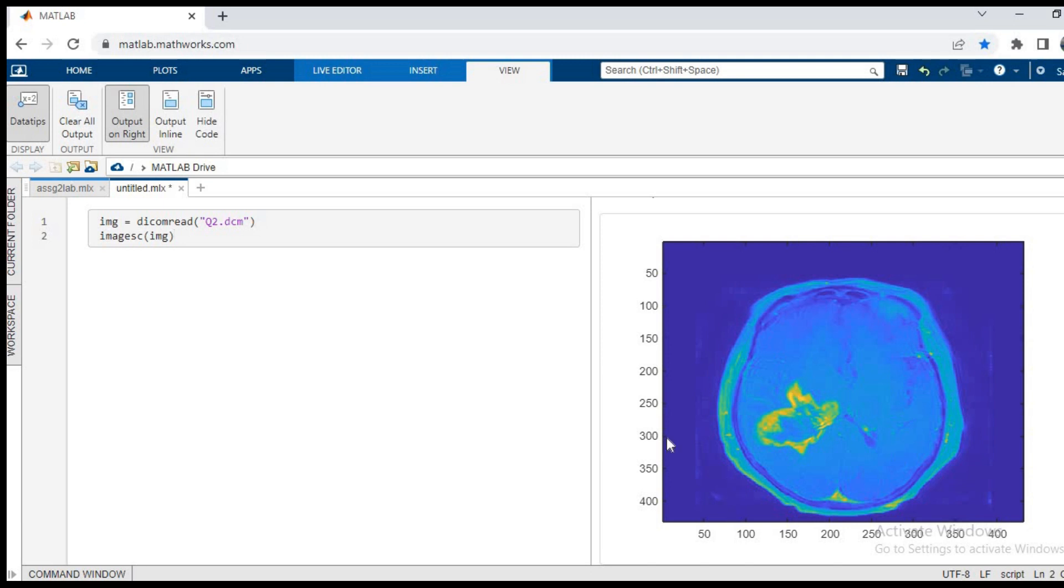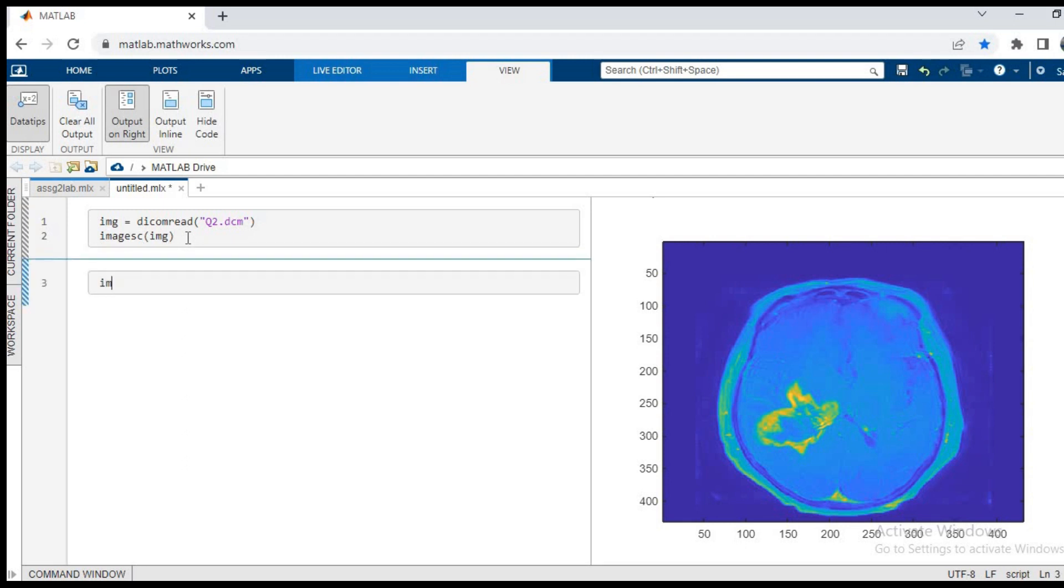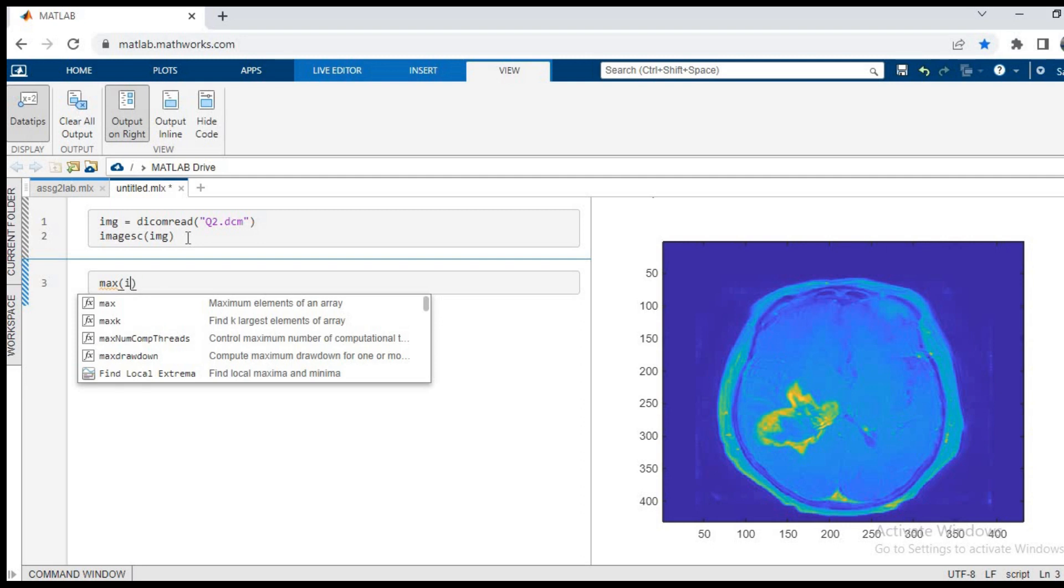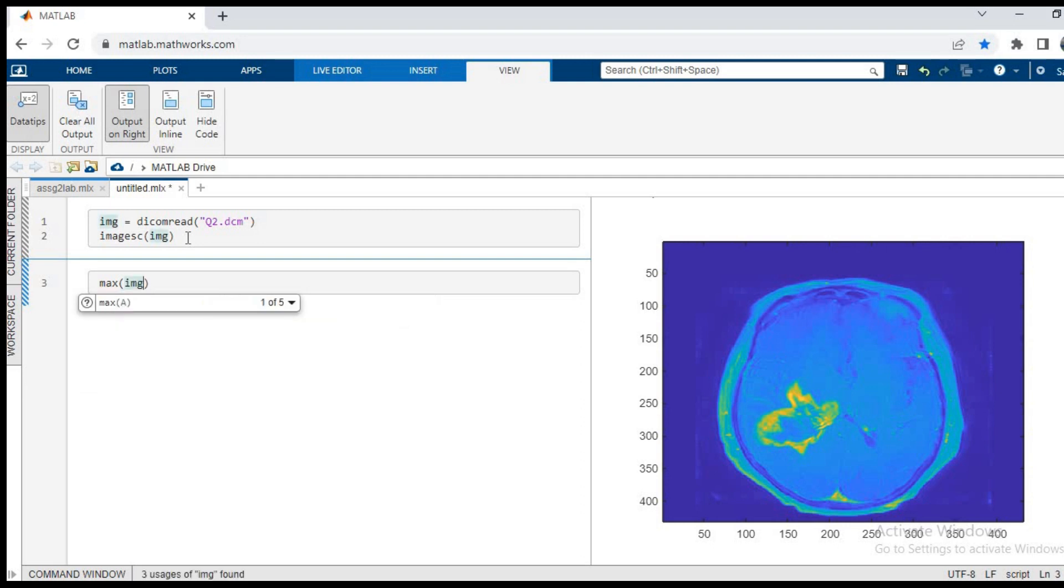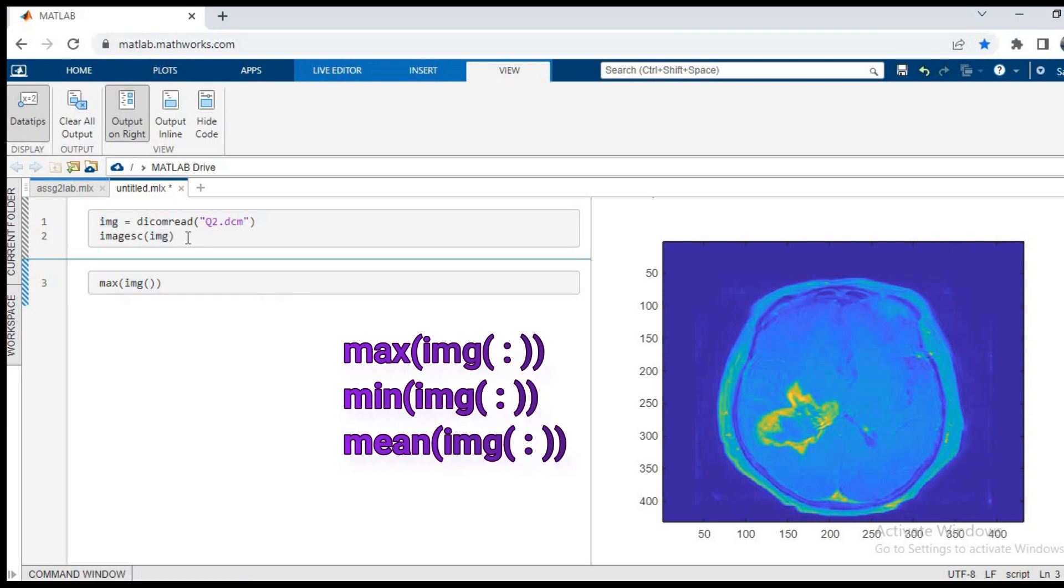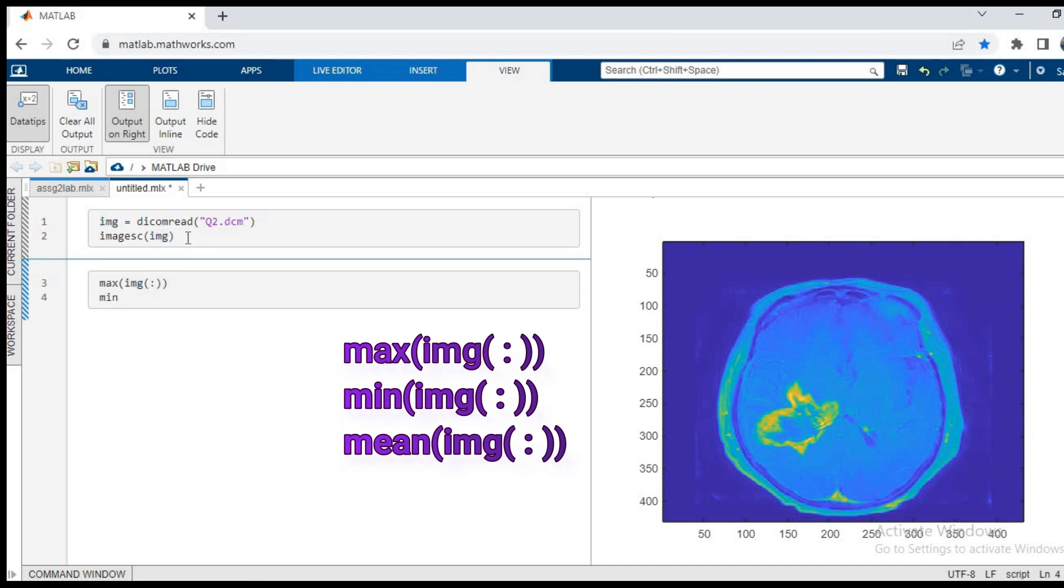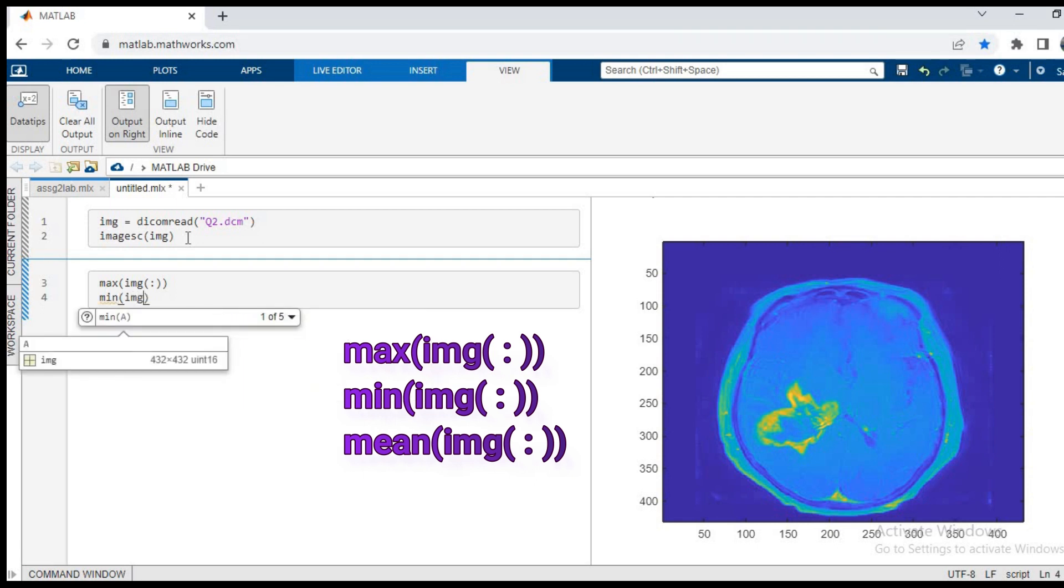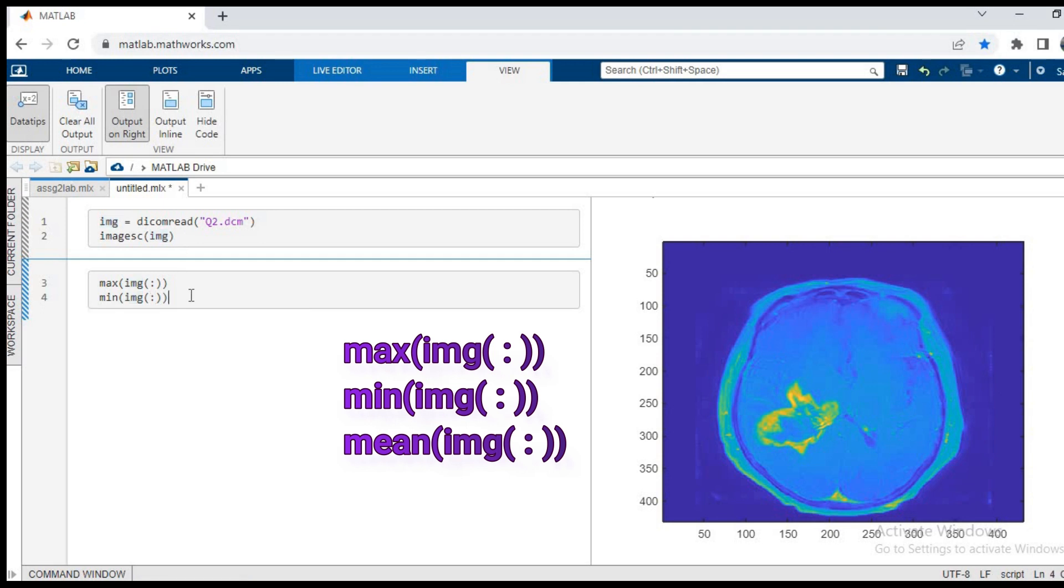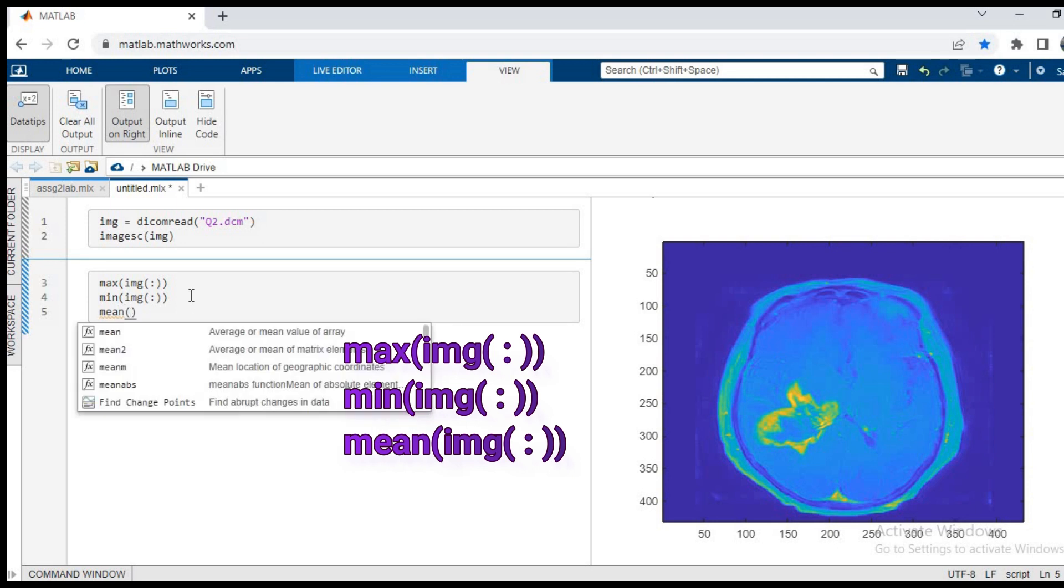We want to see the highest and the lowest. First we'll see the maximum value of the image. We'll pass max of img bracket and then we put a colon so that it checks all the values from end to end. Again, same thing, we'll pass the min function, then we write img bracket and then a colon. This checks the minimum value in the entire image. The third thing we do is mean of img and we pass all the values.